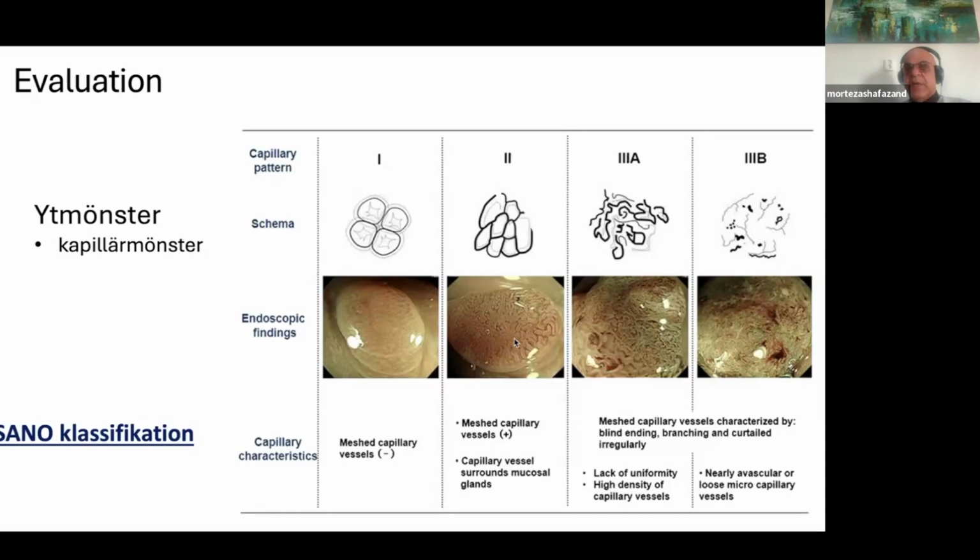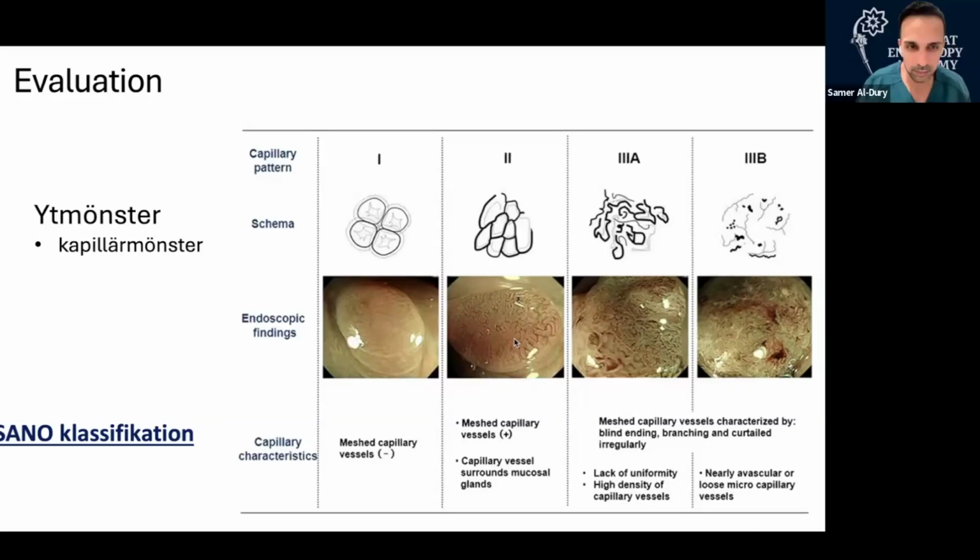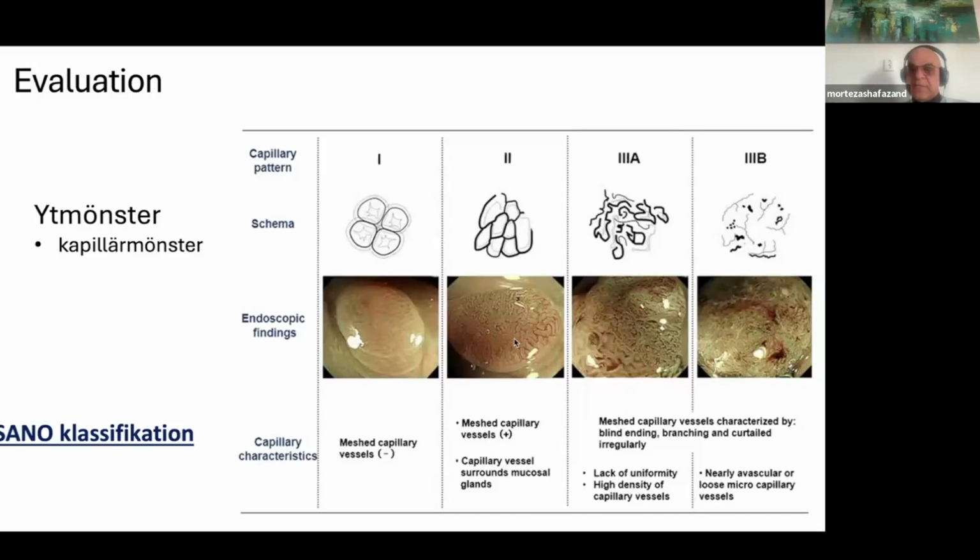Absolutely. And also, with all these classifications, you try to memorize everything, but you are a human being. Was that JNET 2B, high or low? So it's very nice. I also have all those on the wall in the room. Sometimes I'm not completely sure, so I look at the picture. I have seen people have it in their office, then they go back and try to remember how the polyp looked compared with the picture. Have it in the room.